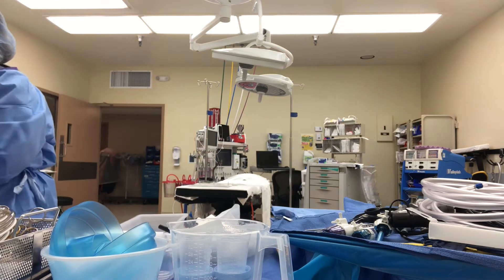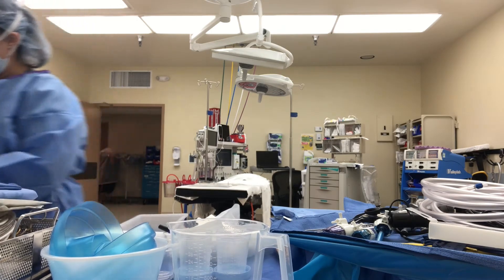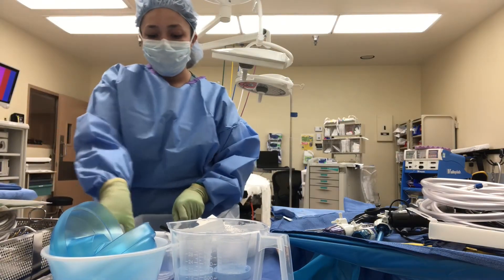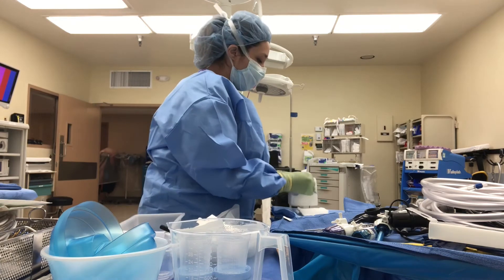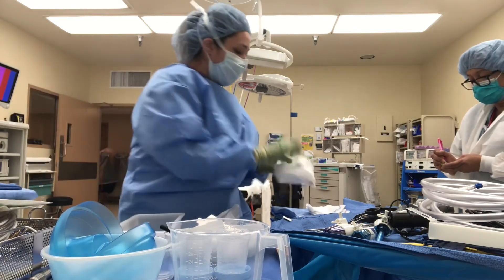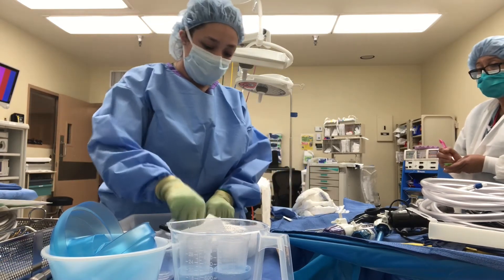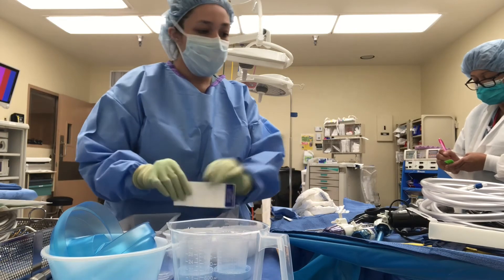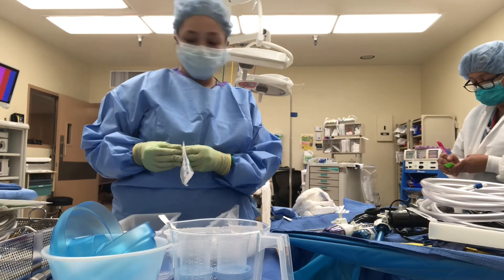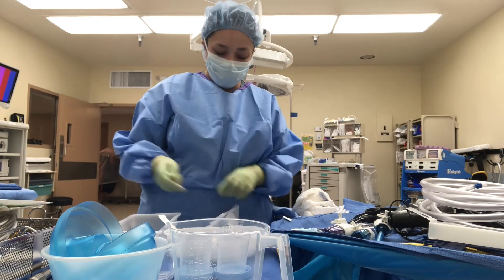Then I just organize the doctor's gown and gloves on the other side of the table where it's more clear, and bring out any other scopes I'm going to use. Here I am counting with my nurse — counting the Raytex, now counting the laps. We count any needles that are on the field, we count bovie tips, and FRED which is the fog clarifier that we use. It comes with a sponge and that's what we clean the camera with when it gets foggy in the abdomen. And we also count hypos.